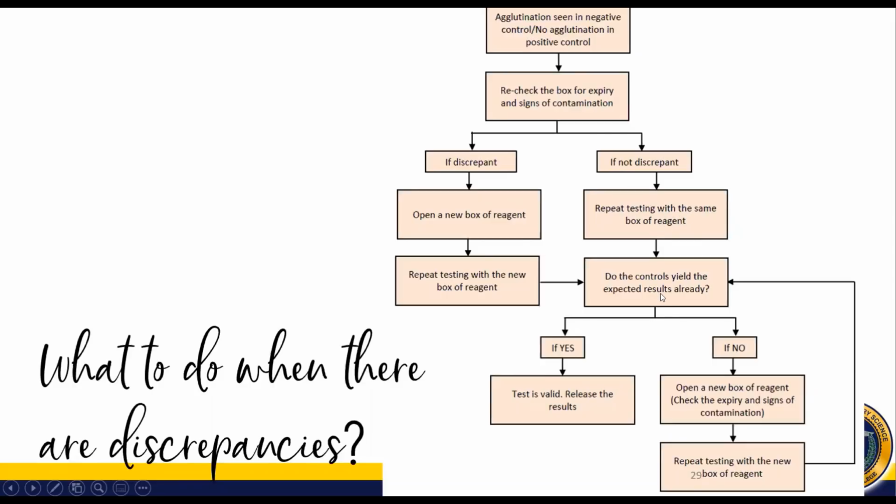Kung positive control, pasok ba? Nag-agglutinate ba sa positive control? Or kung wala bang agglutination sa negative control. Pag na-resolve yung discrepancy class, okay, expected results are observed, then the result of the repeat testing is deemed valid, therefore you can release the result.